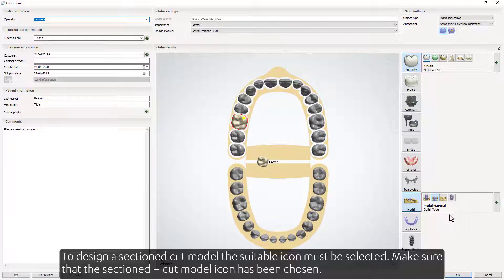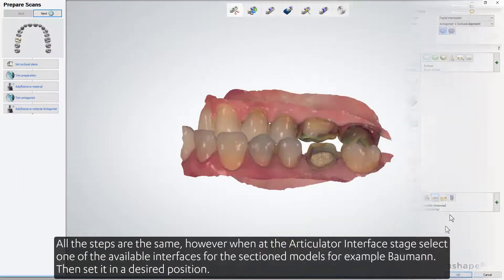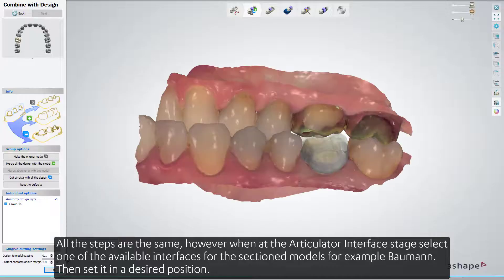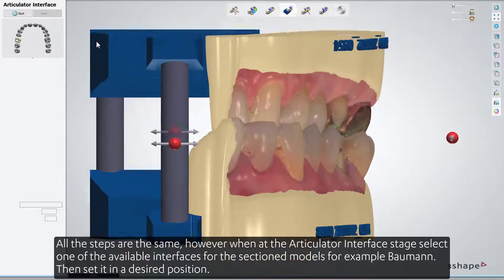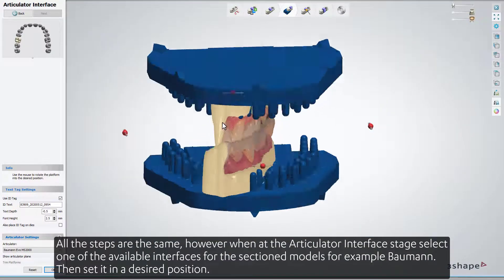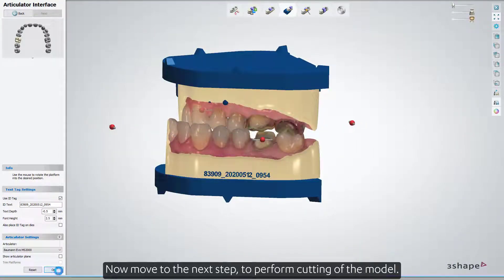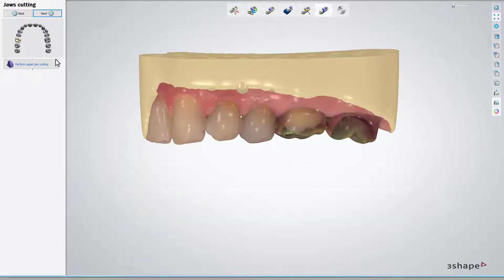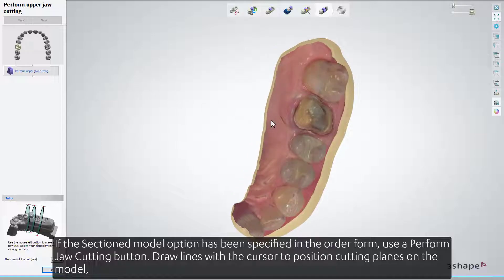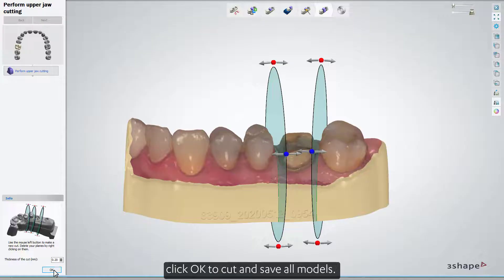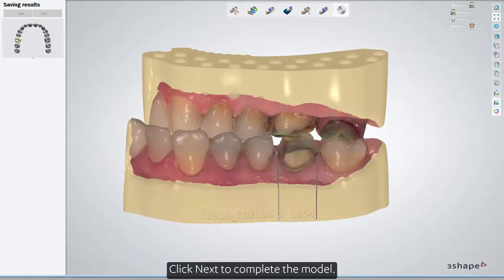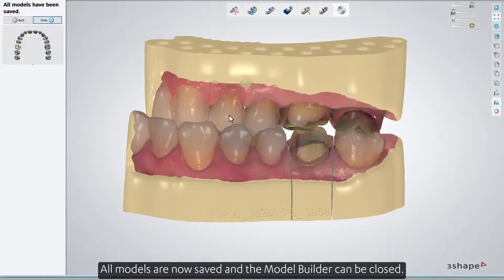To design a Sectioned Cut Model, make sure that the Sectioned Cut Model icon has been selected. All the steps are the same; however, at the Articulator Interface stage, select one of the available interfaces for the Sectioned Models — for example, Bauman — then set it in the desired position. Move to the next step to perform cutting of the model. If the Sectioned Model option has been specified in the order form, use the Perform Jaw Cutting button. Draw lines with the cursor to position cutting planes on the model. Click OK to cut and save all models, then click Next to complete the model. All models are now saved and the Model Builder can be closed.